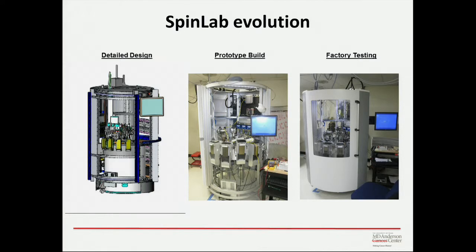It's now evolved into a clinical system. For the engineers in the group, it's gone from a design that has all of the polarizing part, but also has to do all the chemistry in line, because you only have a few minutes between the time you create the compound and when it's going to go away. You've got to get this all through. You have to get it prepared for injection into a human. So there's a significant amount of chemistry that takes place as well as testing.